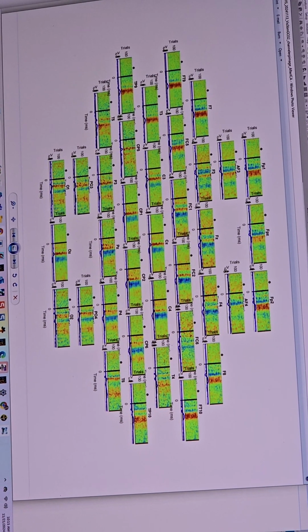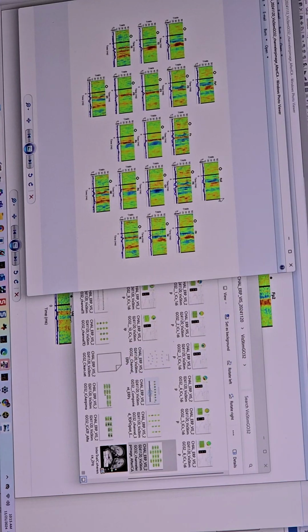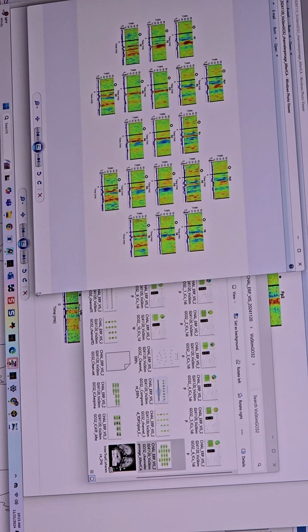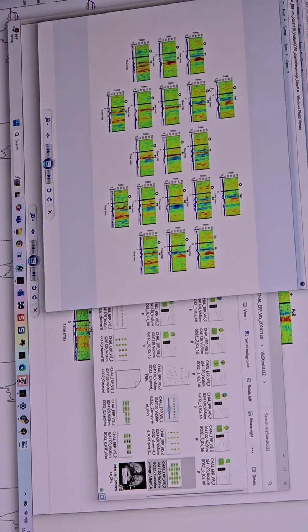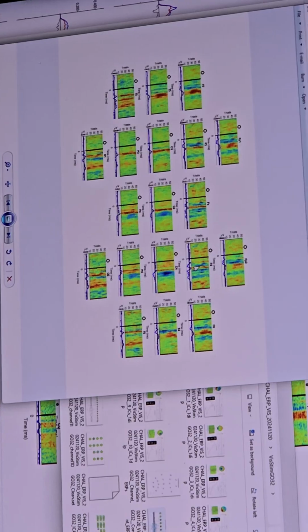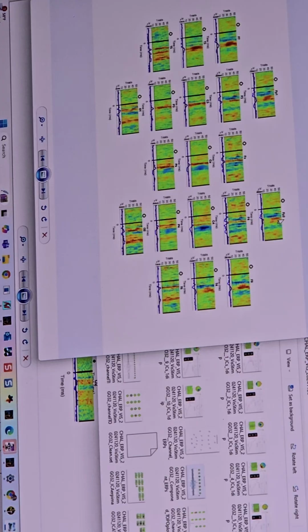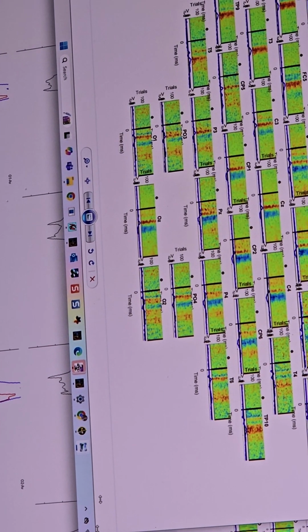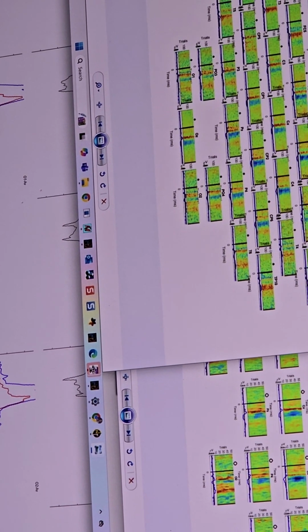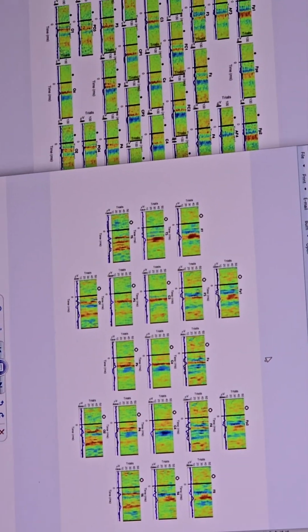Now, in the second one, let's see, we only did 19 channels, but look how much more consistent this is. That's interesting. You're starting to get a nice strong band here. I'd like the F4 to be less messy, and they could all still improve, but if we compare these, the front isn't very dark here, but here it's becoming really dark. So I think this is showing some nice improvement.